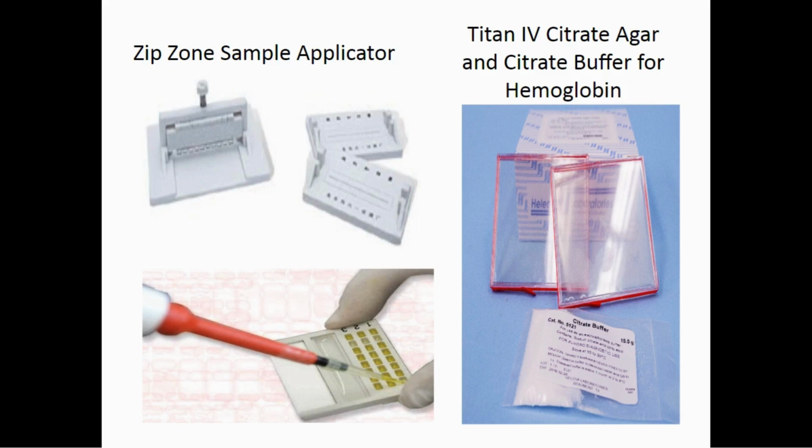The citrate buffer is used as a chamber buffer for the citrate agar procedure. Buffer provides ions that carry a current and maintain pH at a relatively constant value. So basically, the citrate agar allows us to determine the quality and the quantity of the HbS in newborns.